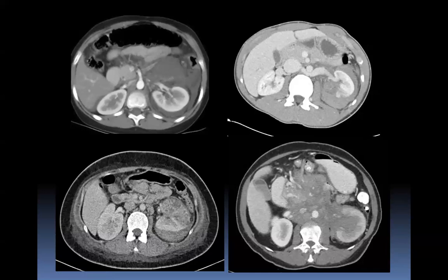Pyelonephritis. Excellent. So this is what we saw in the last lecture. Sometimes you could have pyelonephritis, and you could have a perinephric abscess developing. So this is a case of pyelonephritis, with a striated nephrogram, and this is a perinephric abscess forming there. So again, there is no history of trauma in this case.